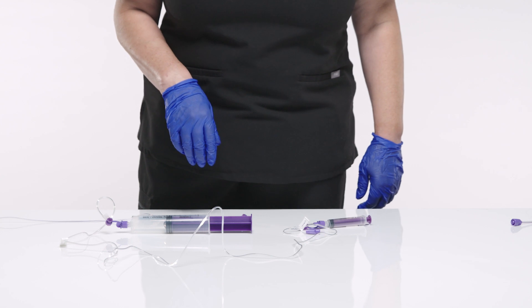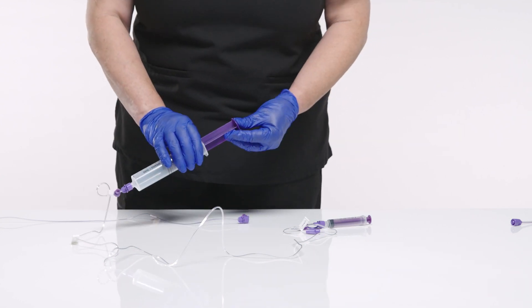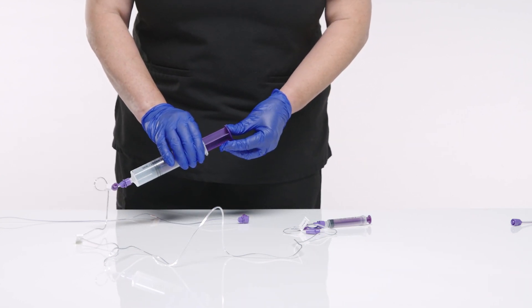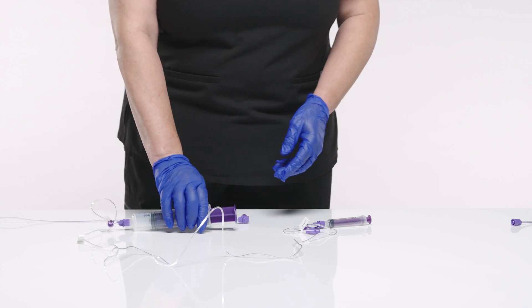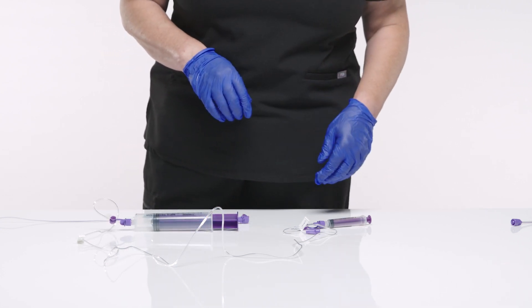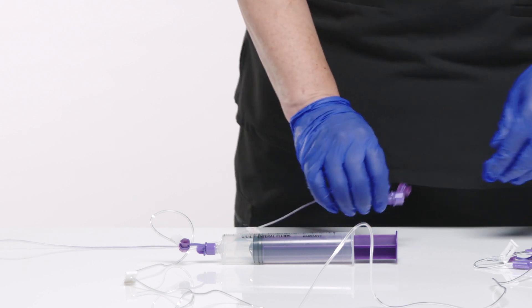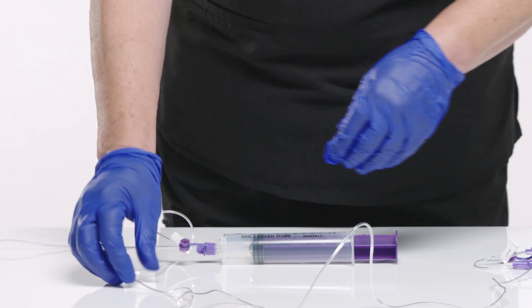To prime the extension set, gently press the plunger of the EnFit syringe until fluid reaches the distal end. The 60-inch extension set will prime with 2 milliliters. Clamp after priming to prevent future flow until ready for the feed.